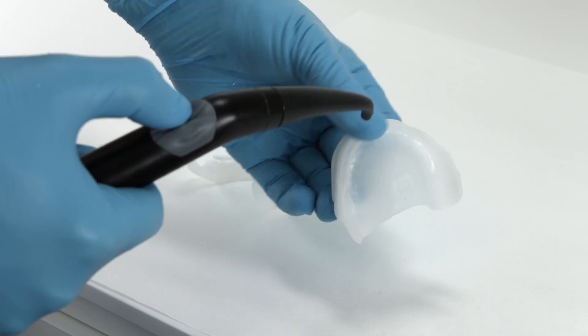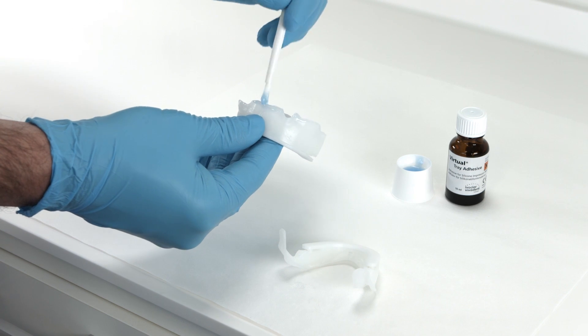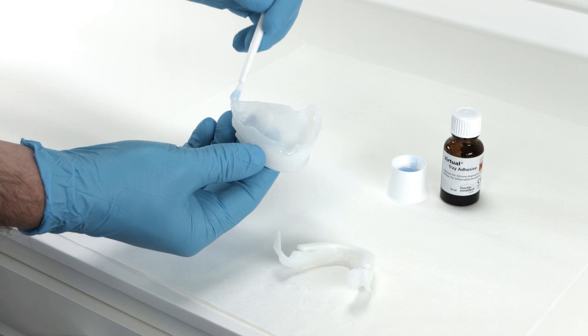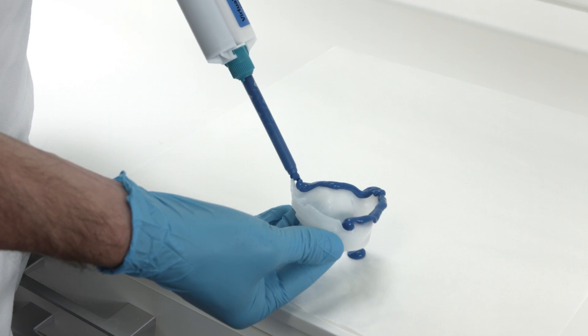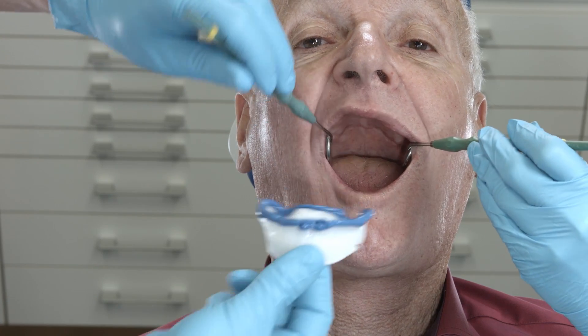Thoroughly rinse the tray and dry it. Apply suitable adhesive around its circumference. On the prepared margins, apply an appropriate precision impression silicone — for example, Virtual Heavy Body — and carefully rotate the impression tray into the mouth.